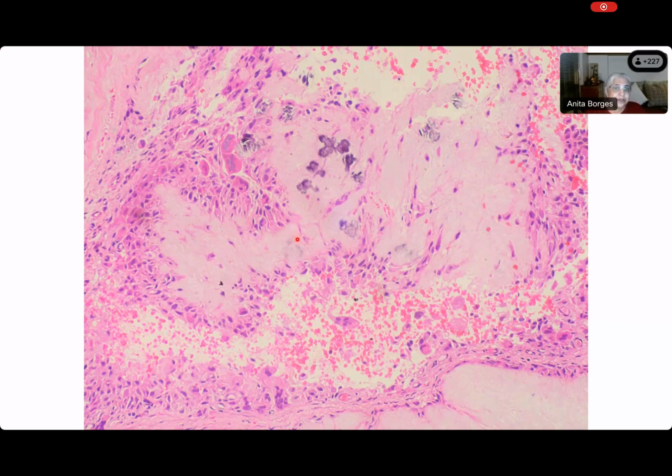But you see that they're not forming small little granulomas like the usual epithelioid histiocytes do. What are they producing? Mansi, would you like to say what this is all doing? And you've seen it before, although you say you've done only 4 months in histopathology. Monica, how many months did you do? 10 months. Now come on, Monica, when you see histiocytes like this arranged in this really typical way, what would you say about this kind of reaction? This is a foreign body type of reaction.